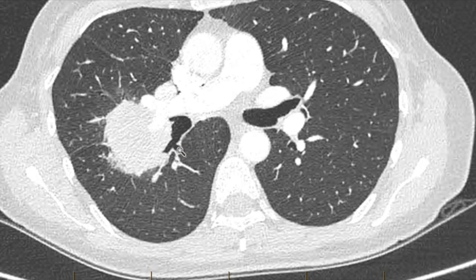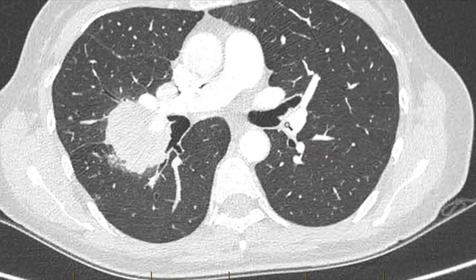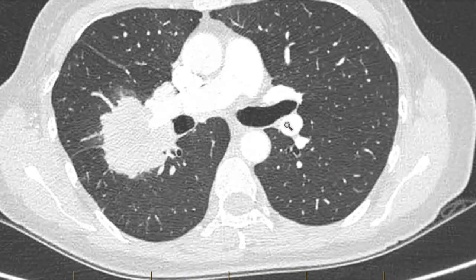Here's the apical segment here coming off posteriorly, and this has three branches. Here's the C branch and the B branch here. Looks as if that comes to an abrupt dead end, so there may actually be an endobronchial lesion there. The bronchoscope can probably reach to about here, so we may see that. We'll have to have a careful look there.